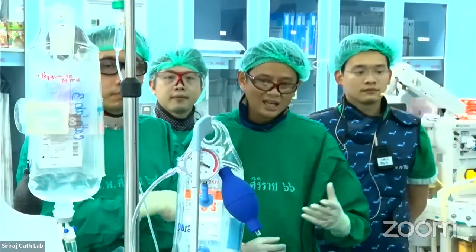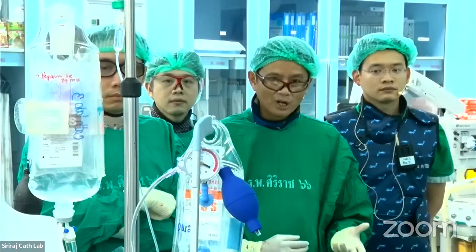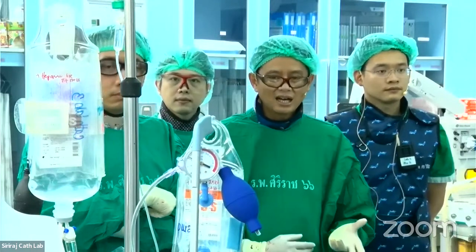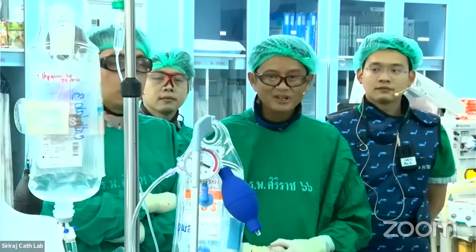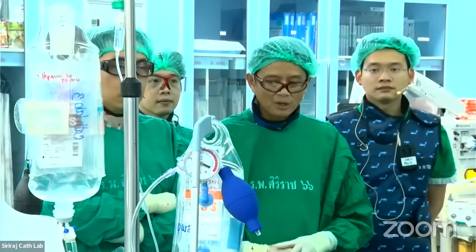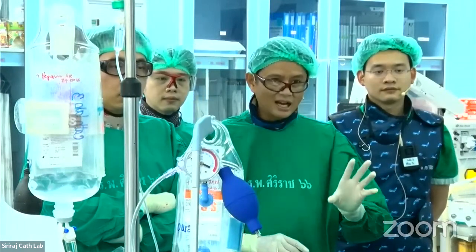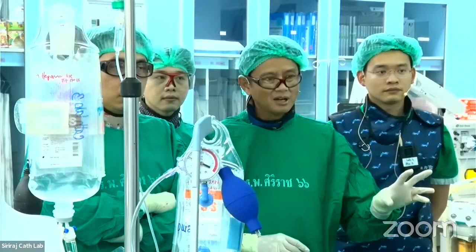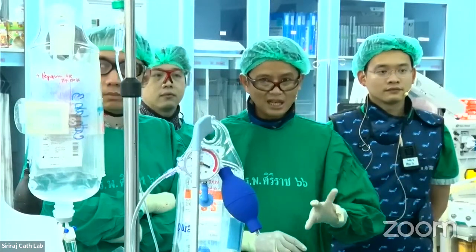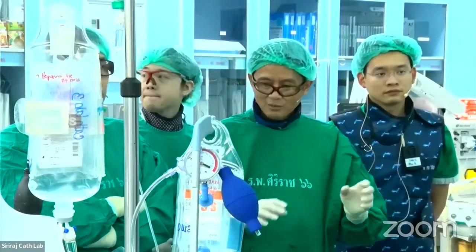And then once we get that final plan, what we plan to do, I think doing left main intravascular imaging is very important. From the angiogram, we have plan A, B, C, D, but based on intravascular imaging, sometimes I have a case like this, I plan for provisional stenting, but then we see calcium in the ostial circumflex and napkin rings. So we have to switch to two stent technique.